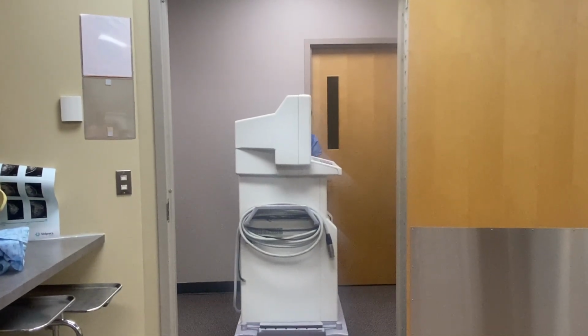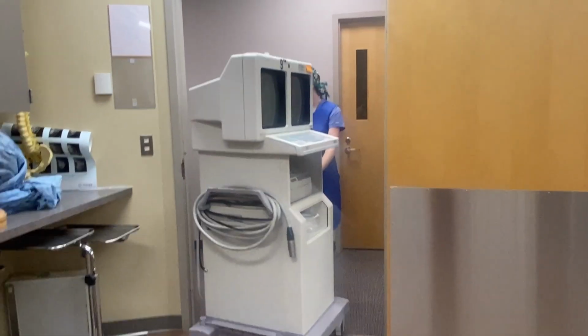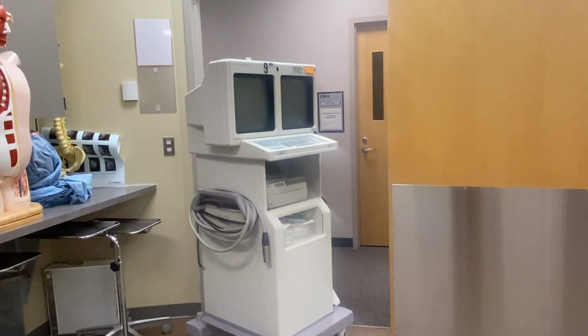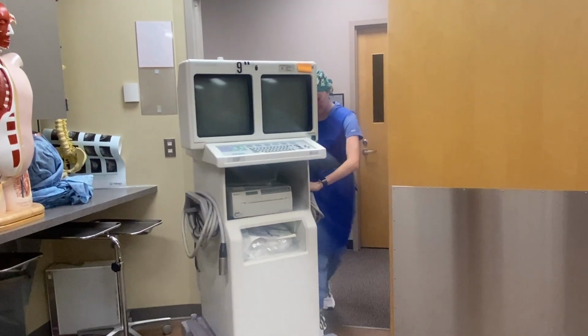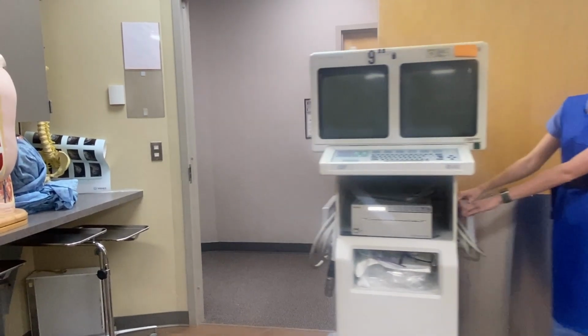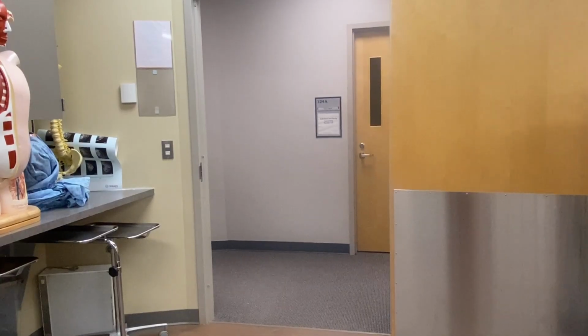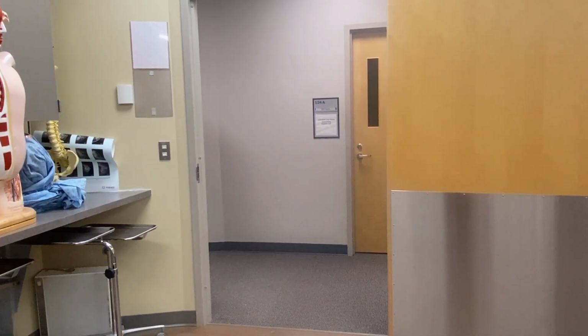In the operating room, precision and real-time decision-making are critical. X-ray imaging provides surgeons with immediate dynamic views of the patient's anatomy, enabling them to navigate complex structures and make informed decisions during procedures. The C-arm takes this a step further.